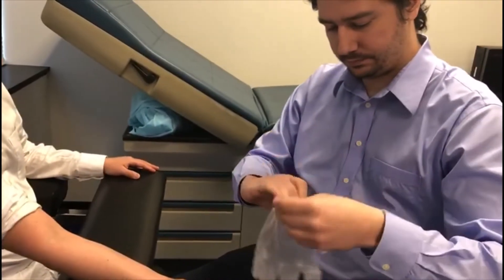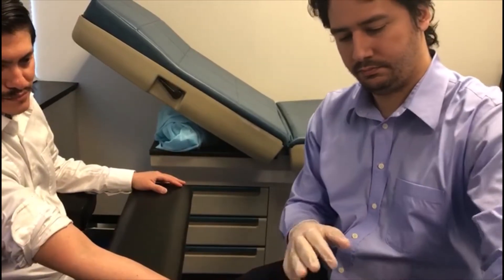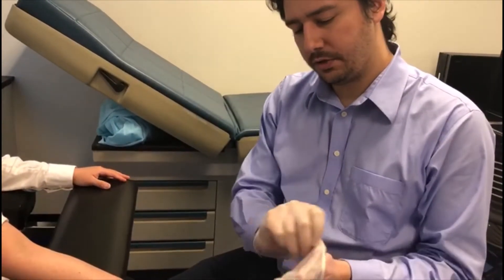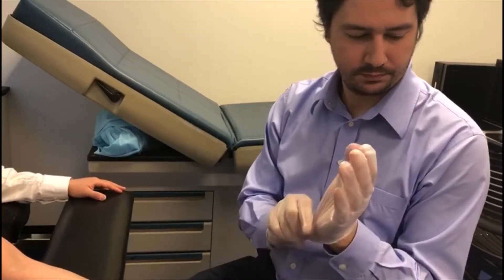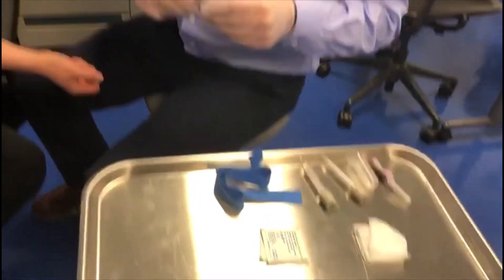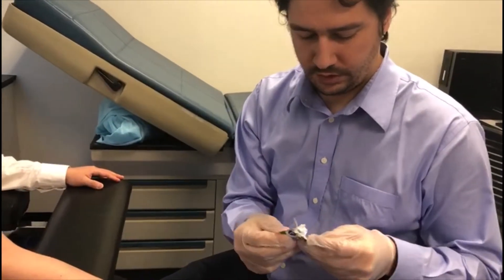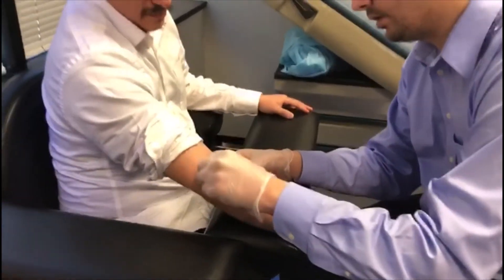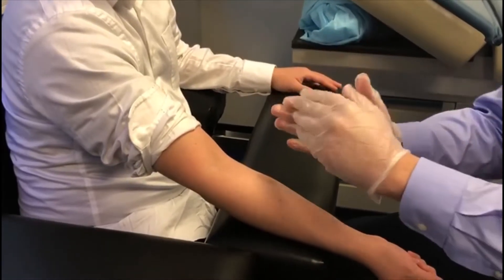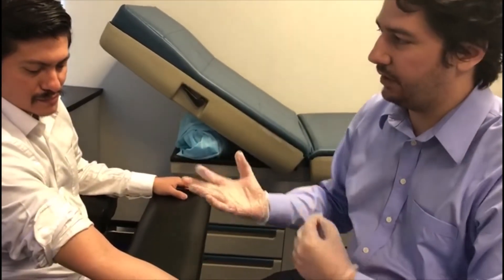We're going to put our gloves on. The whole reason for the gloves is to not just protect ourselves, but to protect our patient as well. We're going to clean the site. I have not set up any of the equipment just yet, and there is a reason for that. We already located the vein — we know where it's at. To use one alcohol wipe, we're going to start at the center and circle out, never going back in. The reason behind that is as we circle out, we are getting the bacteria out. If I were to have circled out and then scrubbed back and forth, I would be getting dirt and bacteria back onto the site.